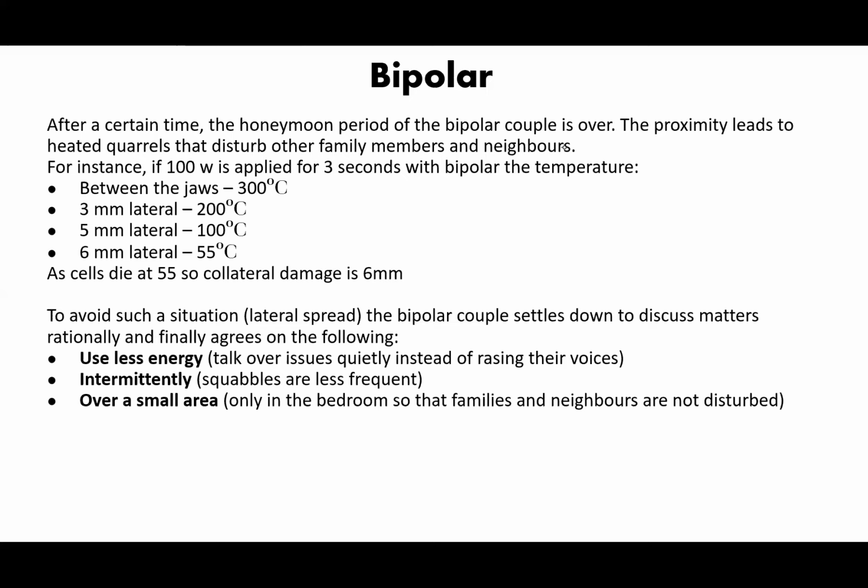To avoid such a situation, okay, lateral spread, the bipolar couple settles down to discuss the matter rationally, and finally agree on the following. Okay? Use less energy. You have to talk over the issue quietly instead of raising your voice. You have to use less energy. Don't forget, when you are using a bipolar instrument, use less energy.